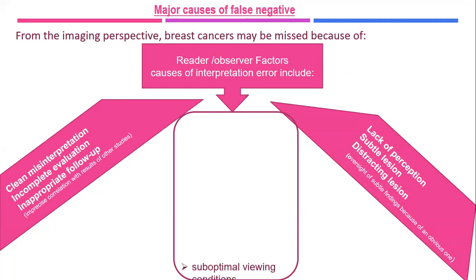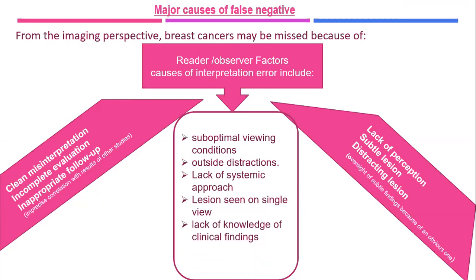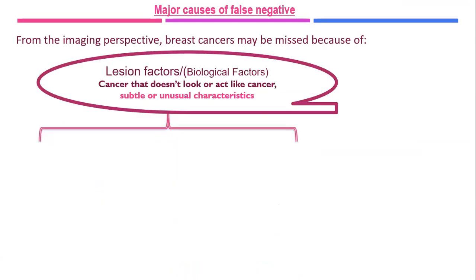These can be influenced by suboptimal viewing conditions, outside distractions, lack of a systematic approach, lesions seen on a single view, lack of knowledge of clinical findings, and non-belief.